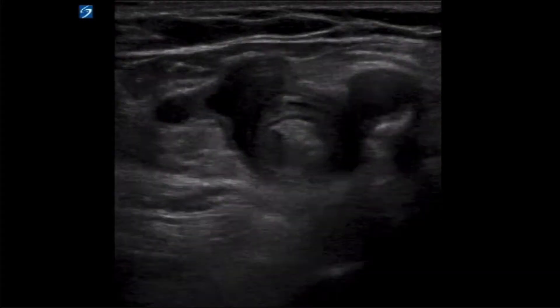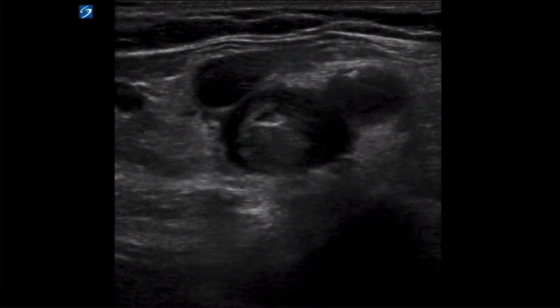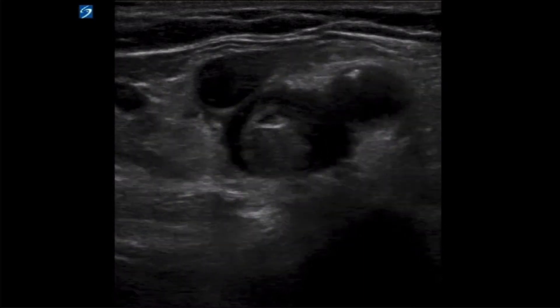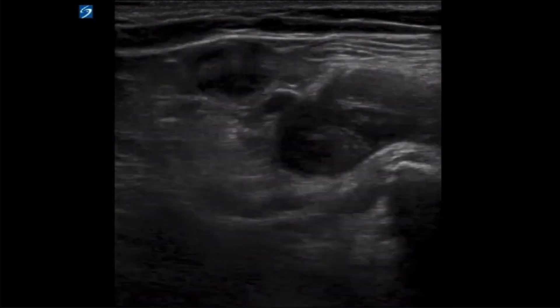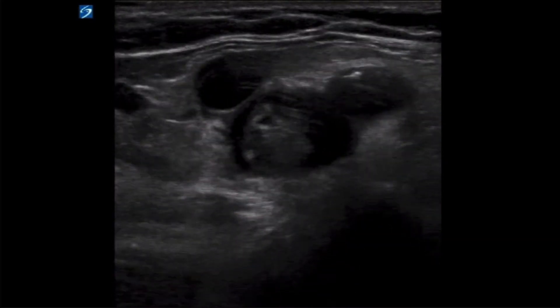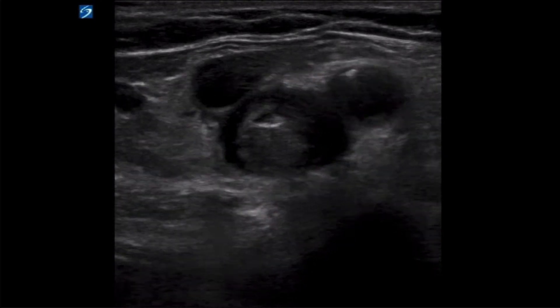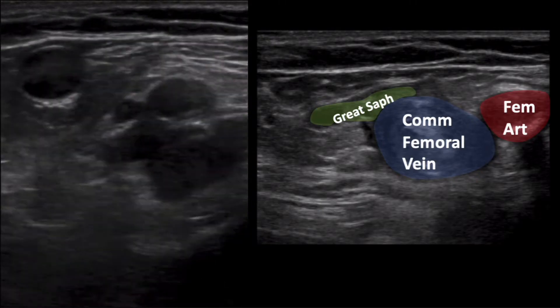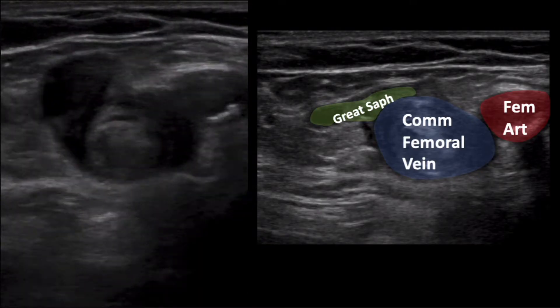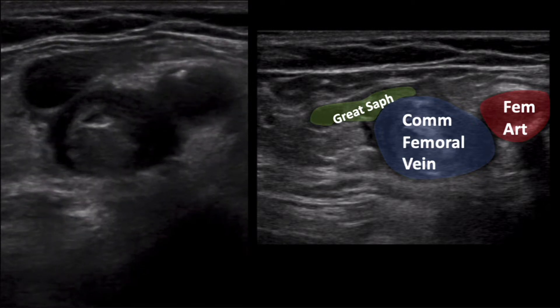Given the appearance of the extremity, we grabbed the bedside ultrasound machine to evaluate. This first image was obtained just below the level of the inguinal crease. If you have experience with lower extremity venous ultrasound, the anatomy should be quite obvious. If you are less familiar, here is a review. The common femoral vein is the central structure with large echogenic material identified within its lumen.